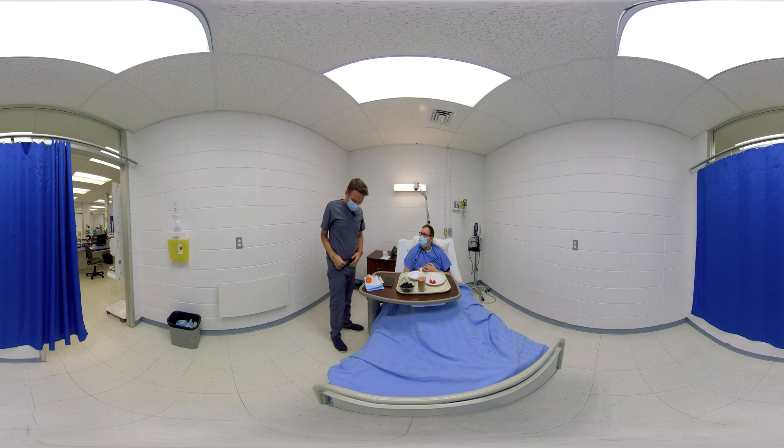Hi again. First we will take a urine sample and then we'll remove the catheter.